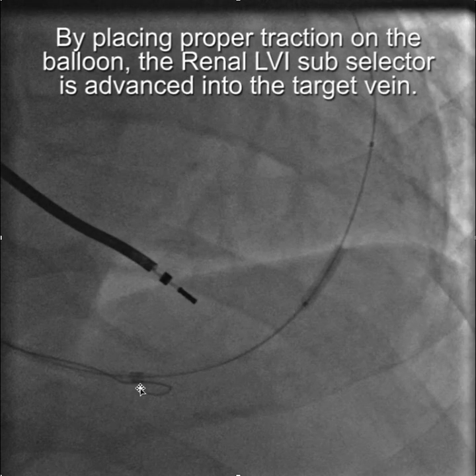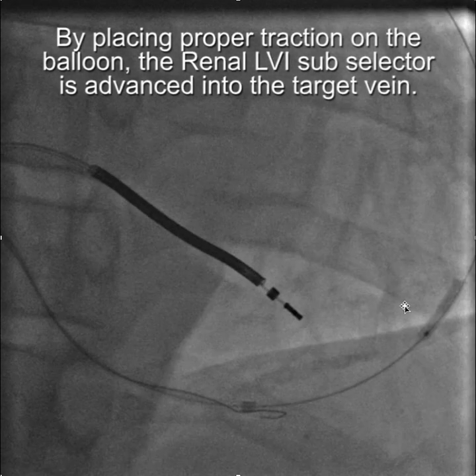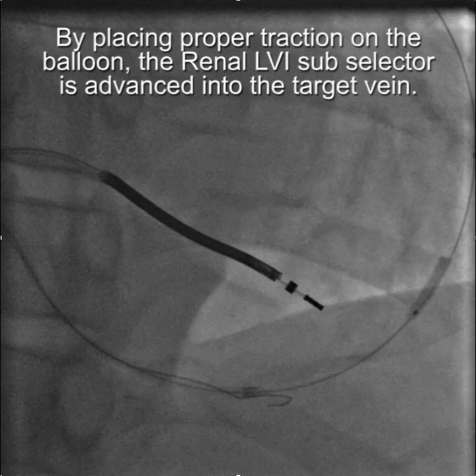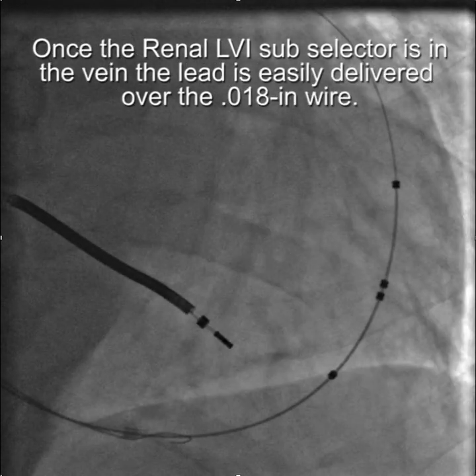And now we have succeeded in getting the subselector into the branch, and you can see that we've actually pulled the balloon back a little bit with the traction. We could have put more. We could have inflated the balloon to a higher pressure and inflated the entire balloon if we needed to, but we had enough traction to get it in.